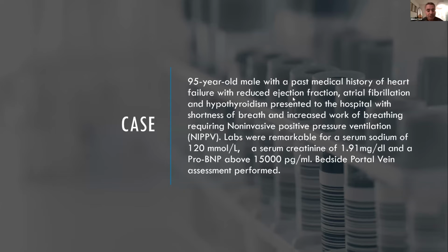If you have an exacerbation of your baseline pulmonary hypertension, you can have an acute on chronic pulmonary hypertension exacerbation. If you have a dilated IVC and portal vein pulsatility and the hepatic vein is extremely abnormal and you have AKI, you probably need to decongest that patient. It's an acute on chronic component of this pulmonary hypertension. Whereas at their baseline state, they may have had a dilated IVC, but they may not have had portal vein pulsatility or abnormal hepatic veins or renal veins. I hope that answers your question, but that's an extremely complex question that requires a nuanced answer, and hopefully I gave you enough nuance for that.